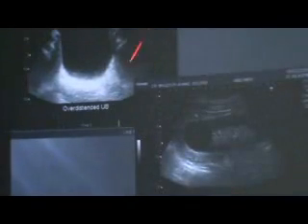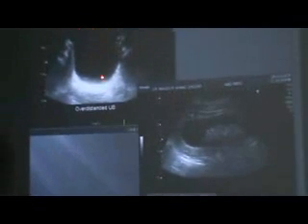As you can see here in the urinary bladder, all the ultrasound waves pass as such through the fluid of the bladder, and they get reflected only from its posterior wall. So the posterior wall looks brighter as compared to the anterior wall, and this is labeled as the posterior enhancement. And this helps us to differentiate between a cystic and a solid structure.